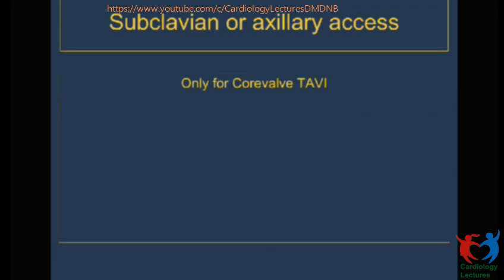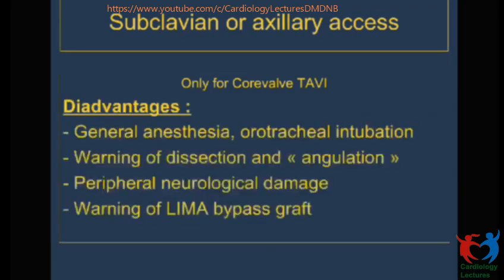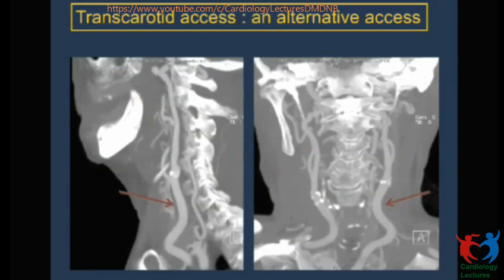Subclavian, I will be very quick, it's only for CoreValve. And now we are using more and more transcarotid access. It would be the common carotid that we check on CT. When we do our CT, we check everything from the carotid to the femoral in the same exam.